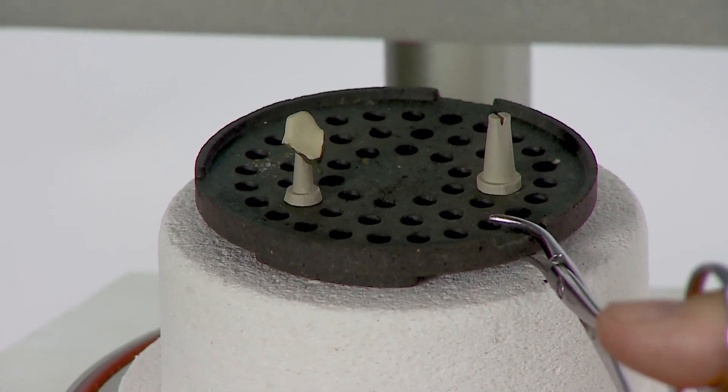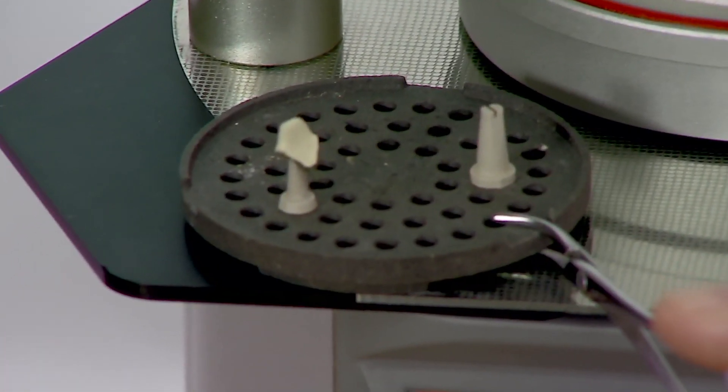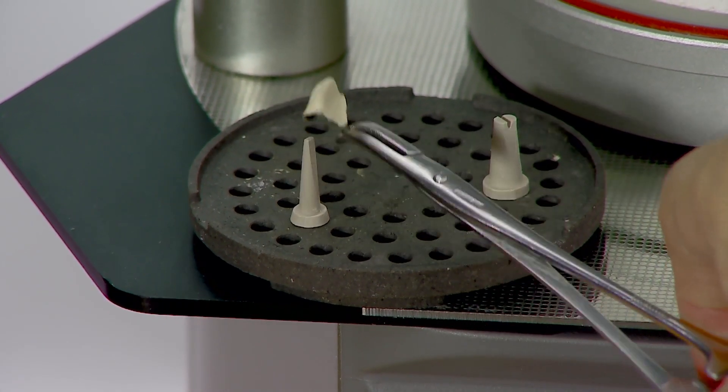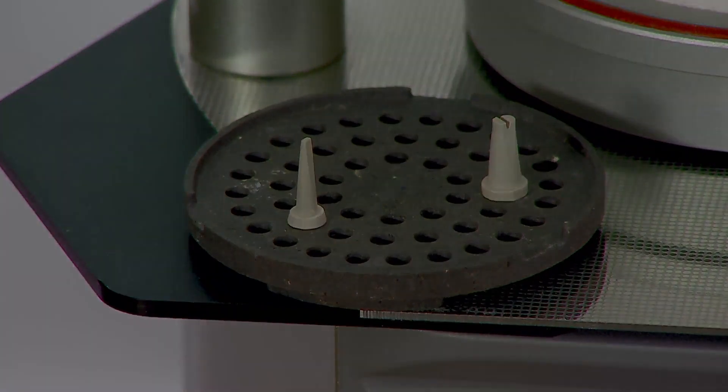Remove the firing tray with the coping from the firing table and allow it to cool. Reapply the shade opaque paste only in areas where metal shows through and then fire again.